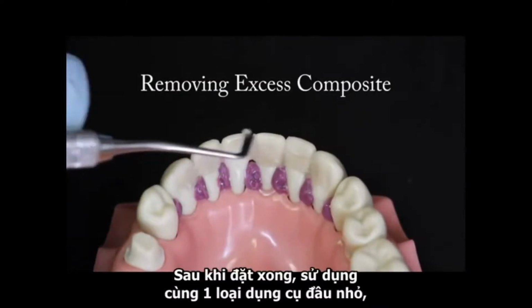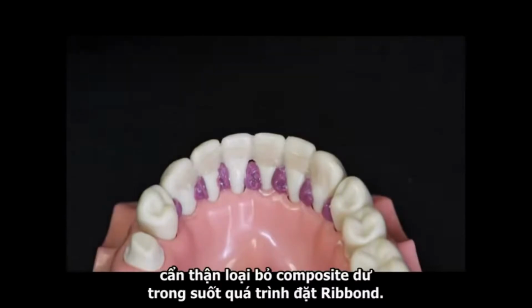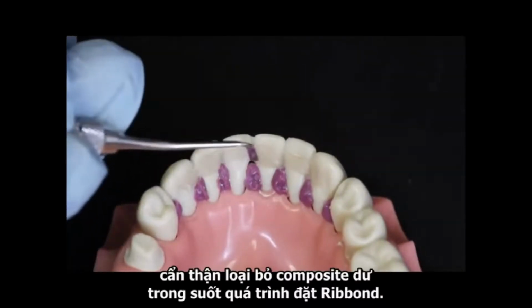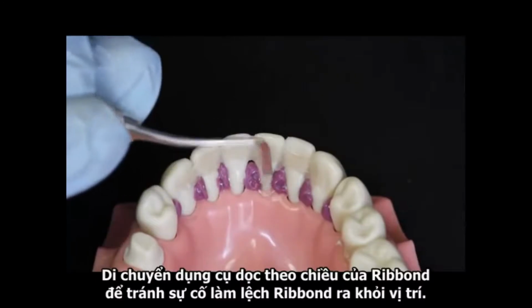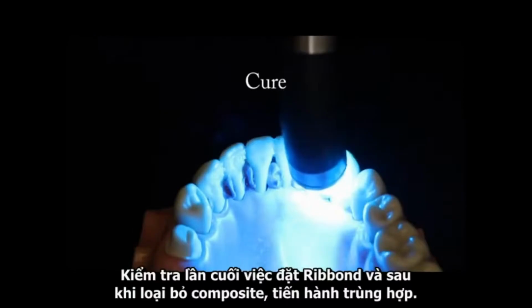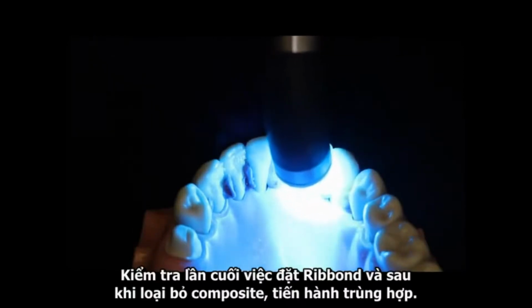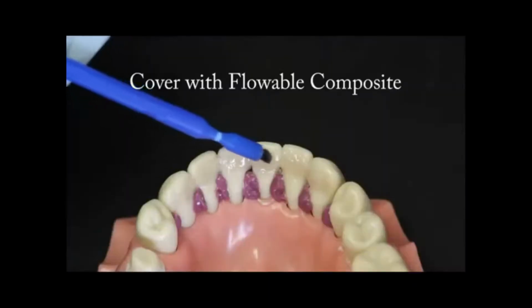After placement, using the same thin-tipped instrument, carefully remove the excess composite resin that was displaced during the adaptation of the ribbon. Move the instrument parallel to the lengthwise orientation of the ribbon to avoid accidentally displacing it. Check the final placement of the ribbon, and after the removal of the excess composite, polymerize.